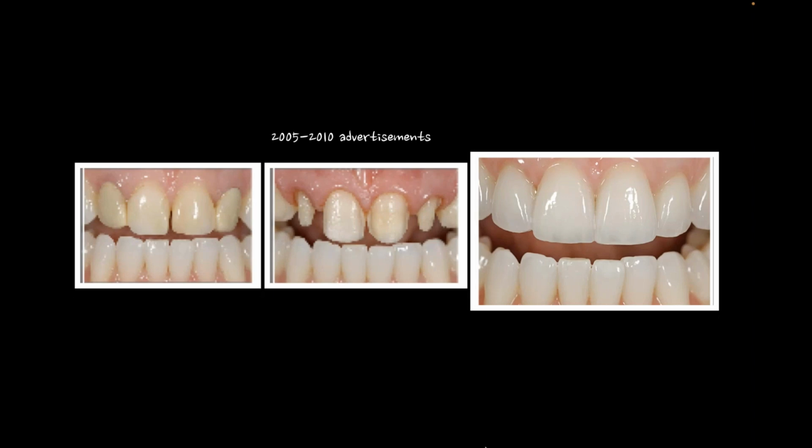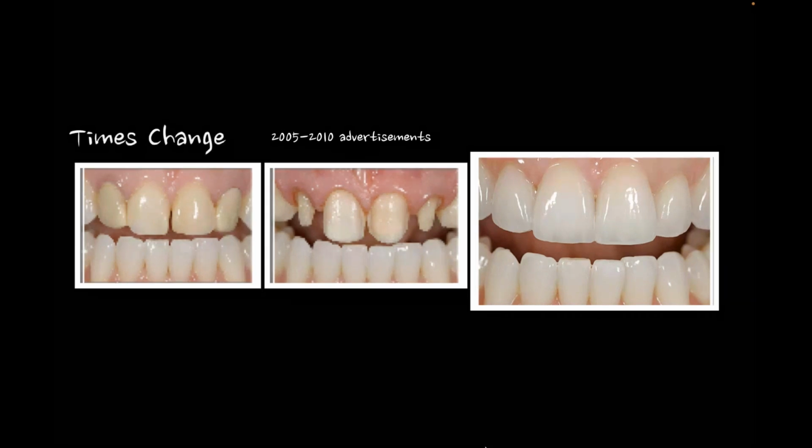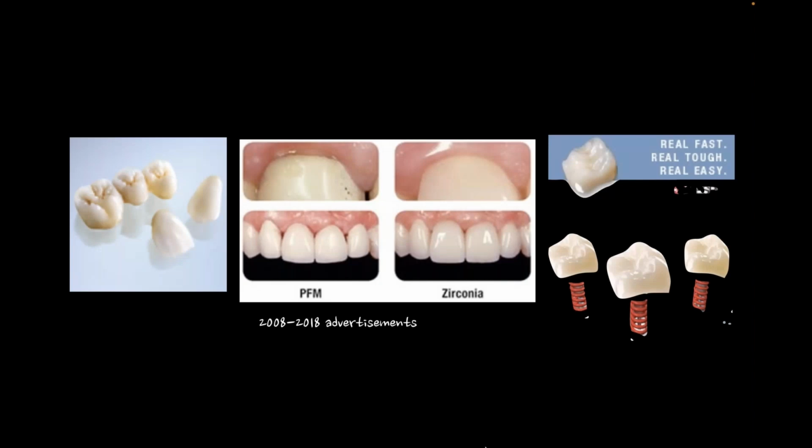And I think we saw a lot of this from the 90s up to about 2010, where our focus was so much on aesthetics and on restorative. Somewhere around 2006, 7, and 8, that changed, right? And it changed for several reasons. One of the reasons is that zirconia and alumina became products. And all the ads started going in this direction: really fast, really tough, really easy. These words kind of drove me crazy. And the concept of the artistry really seemed to be taken away.